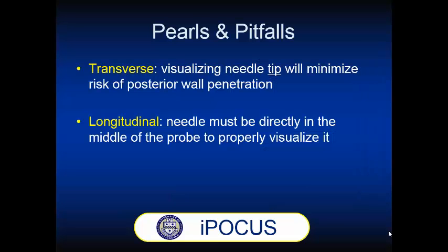As a reminder, a common pitfall with the transverse approach is not visualizing the needle tip and consequently penetrating the posterior wall. In the longitudinal orientation, the challenge is aligning the catheter precisely along the midline of the transducer.